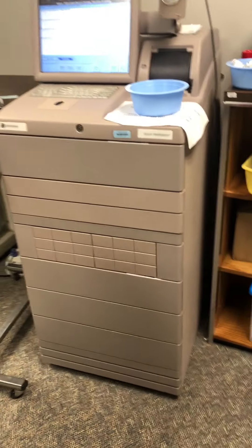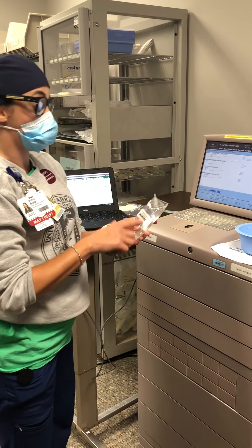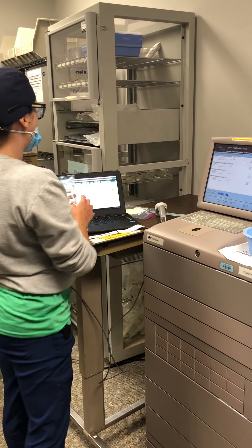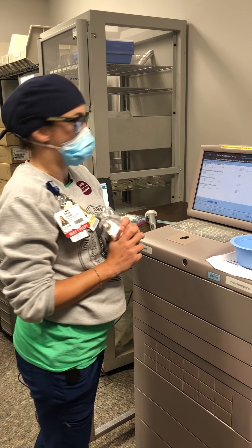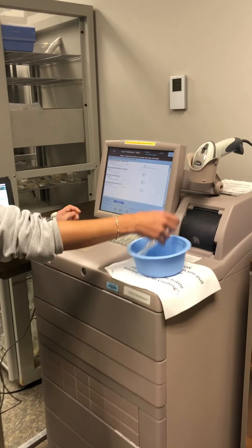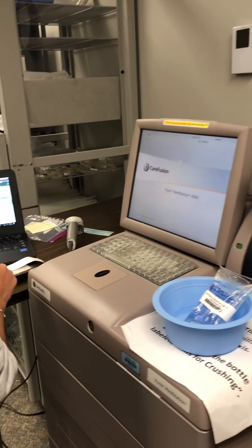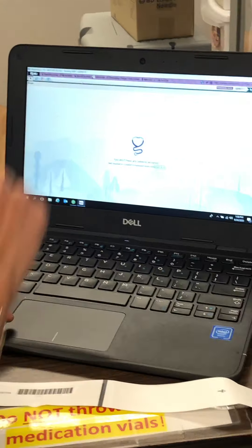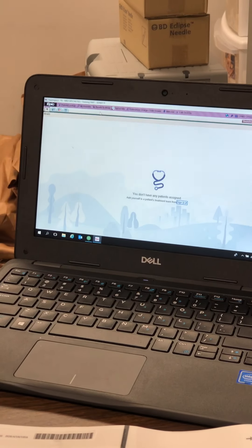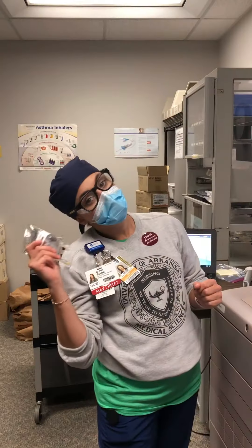You cannot rely on your pharmacy techs to always fill the Pyxis the way it should be filled. It's your responsibility to check this the three times you're supposed to check it before you give it to your patient. Once I have my med, I'm going to put it in my bowl and I'm going to exit out of the Pyxis and exit out of my patient right here. And then we're going to leave this ready for the next group. That is how you pull a med from the Pyxis.